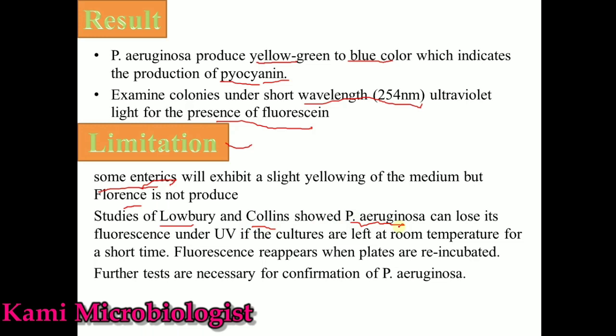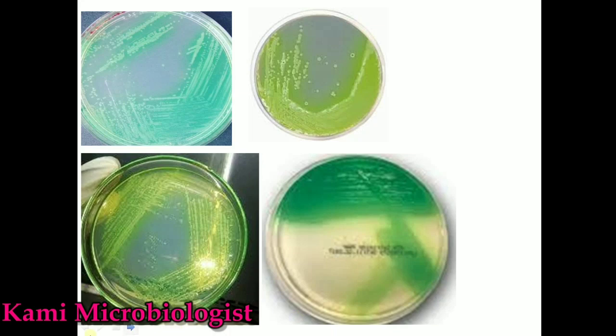This lack of fluorescence occurred because the Pseudomonas was kept at room temperature — if kept at room temperature, it will not produce fluorescence under UV light. To reduce this limitation, the Pseudomonas should be reincubated, after which it can easily be visualized under UV light for fluorescence. Therefore, we conclude that further tests should be performed for the complete identification of Pseudomonas aeruginosa. As we can see in the pictures, these are different strains of Pseudomonas aeruginosa growing on this media.